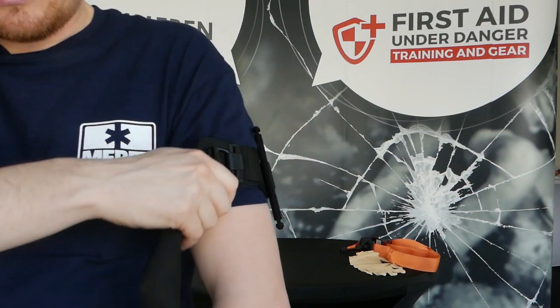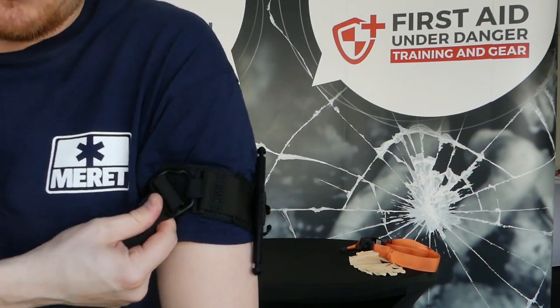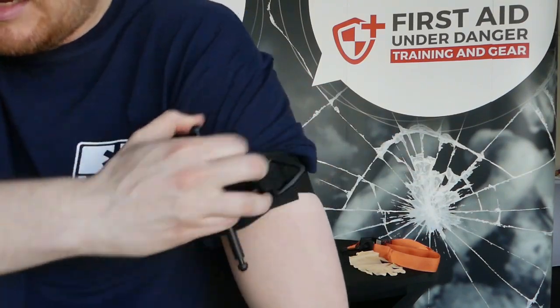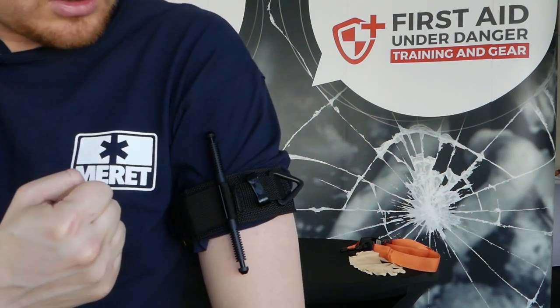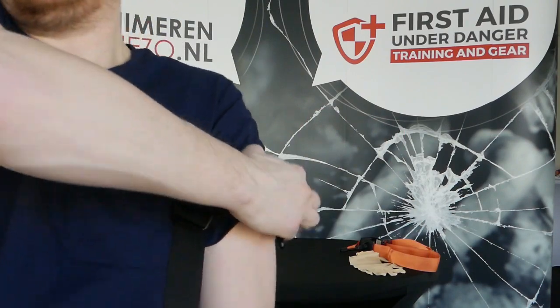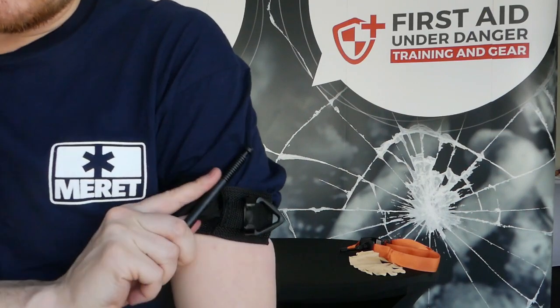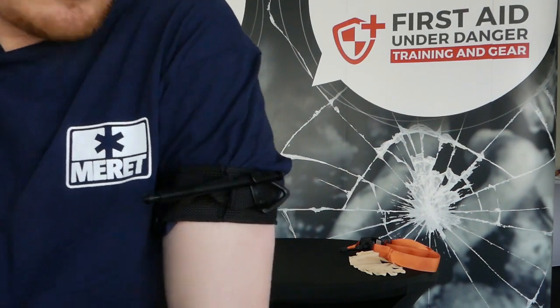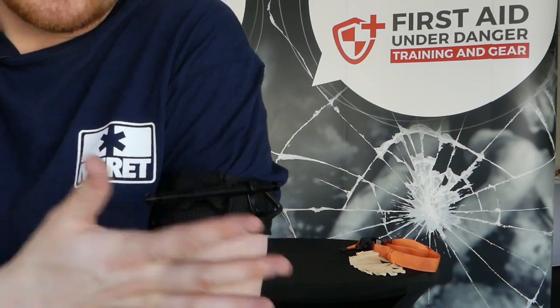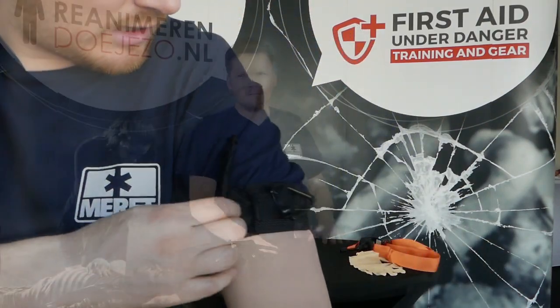secure the tourniquet or get it as tight as possible as you can with a Combat Application Tourniquet. And then I have the problem that my tourniquet rod is here and I need it here. So if it's really strong, really secure, it might be much harder to get it from here to here and then turn it. But I do believe that this is much easier, because this triangle bit never really worked for self-application. So I do believe that this is a really good thing that they did.